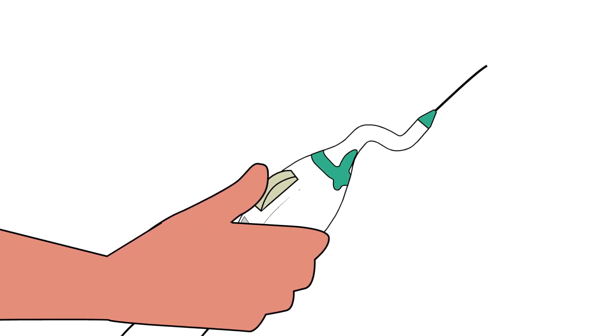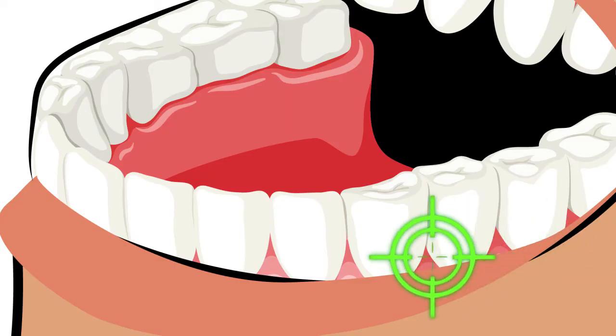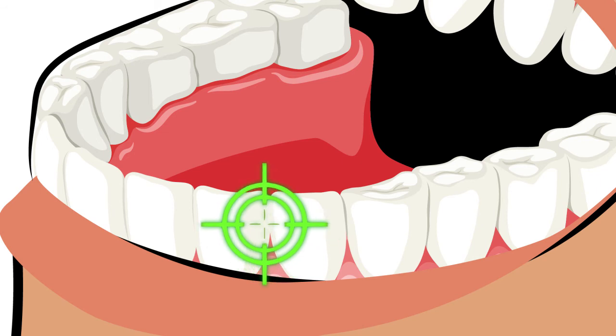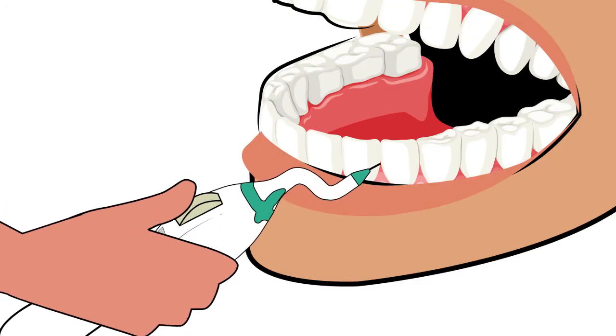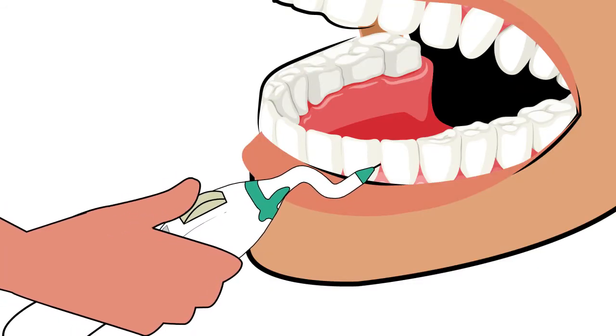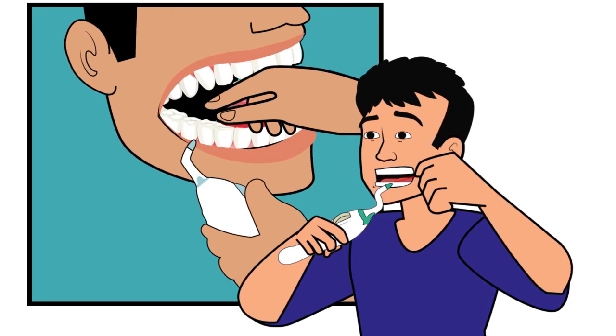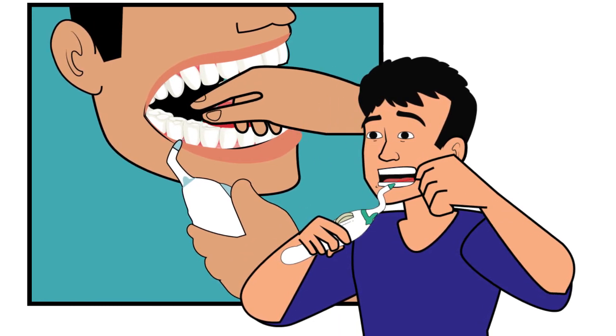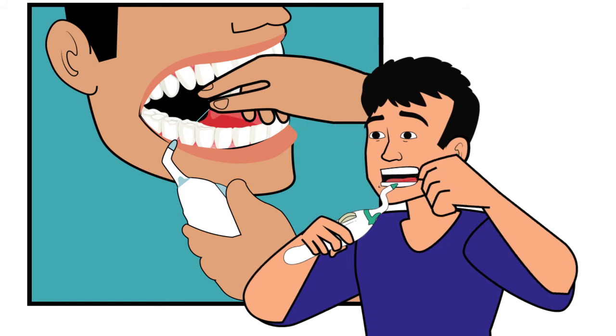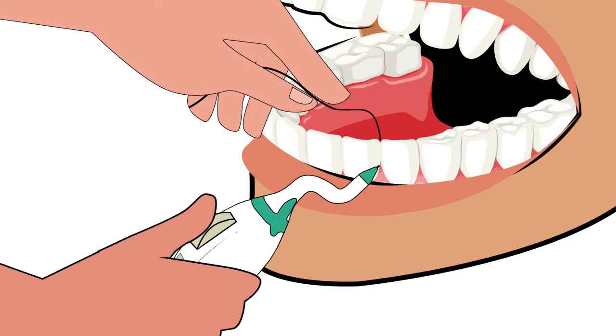Now, point the conical end of the loaded AutoFlosser into the dental space that you would like to clean. Continue to turn the drive wheel with your thumb in a direction away from the tip. As the leader end emerges from the opposite side of the dental space, hold the end using your free hand and pull the floss partially until the scrubbing section is centered in the dental space.